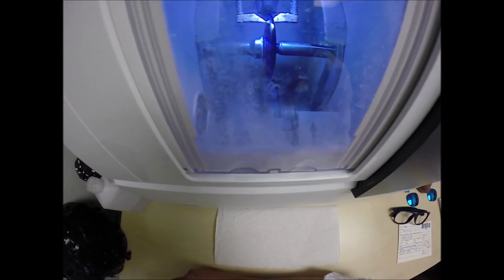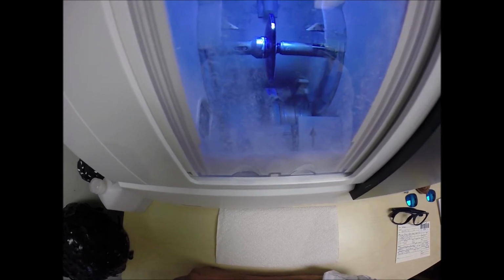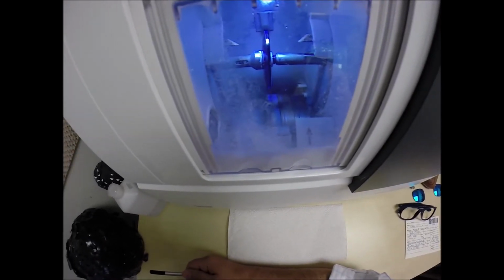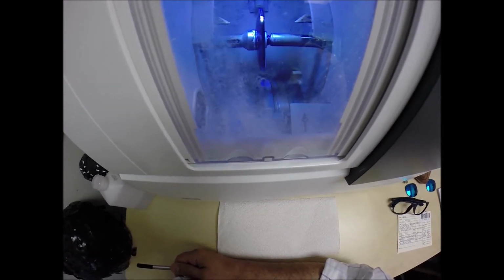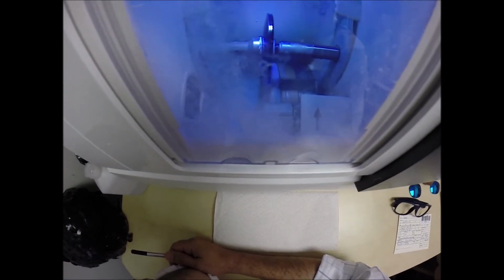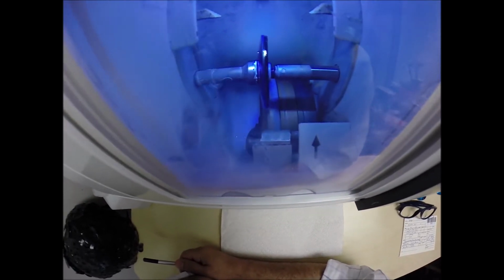And the old Jewish carpenter saying, love thy neighbor as thyself, as well as measure twice, cut once. It's measuring the thickness of the lens at every point to know exactly and precisely where to place the bevel so you have the least amount of edge thickness showing. Now the lens is dropping down onto the cutting wheel, which you can't see because of the dirty door.